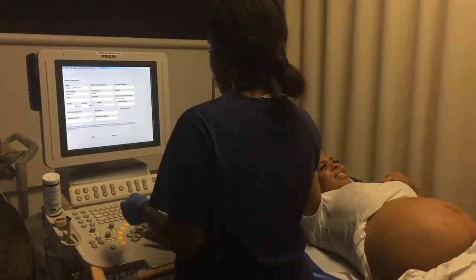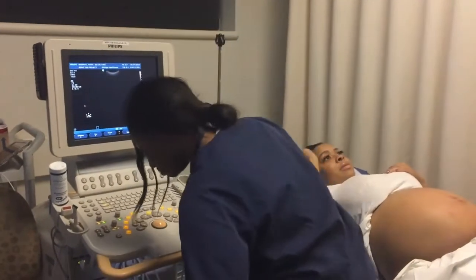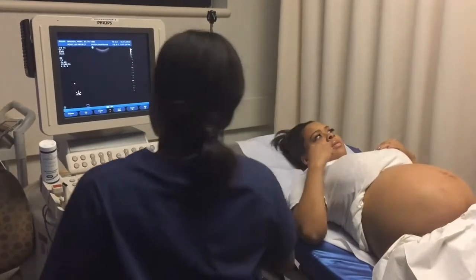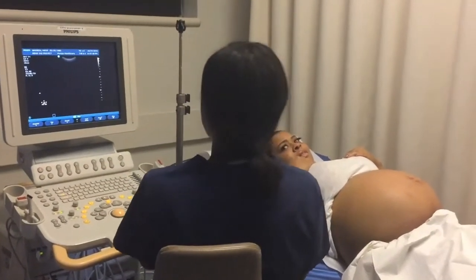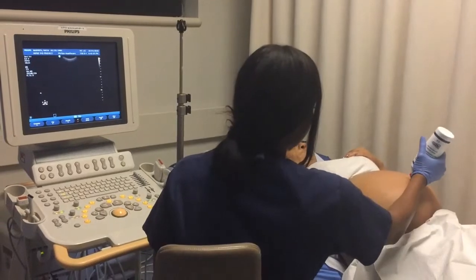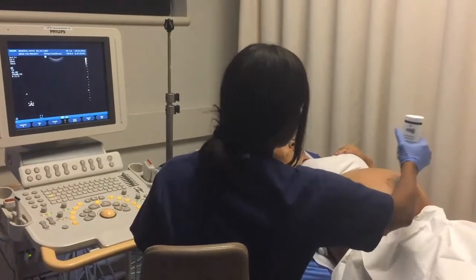Always begin the exam by confirming the patient name and information such as date of birth and asking for gravida, para, and gestational age to make sure that you have the right patient. In this video clip, this patient is 34 weeks pregnant, and this is her first child, and she is feeling some back pain, but overall she's having a healthy pregnancy.